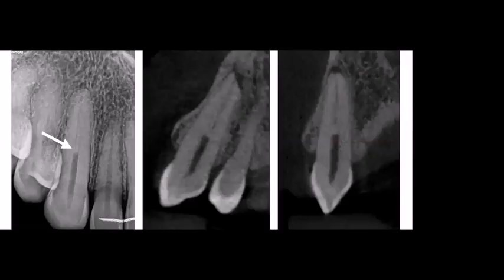For example, here we can see a case. The root canal is straight. There is no curvature. But we have to know that we can have a fracture due to torsion in a straight canal. Why? Because the torsional stress is due to the contact between the file and the walls of the root canal.